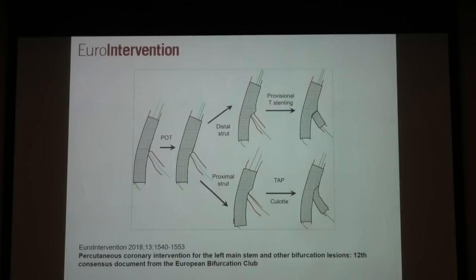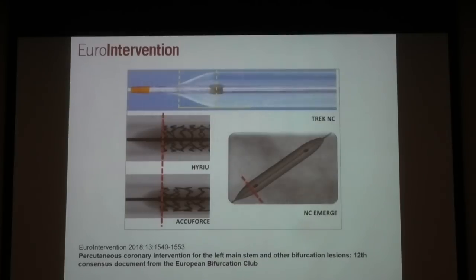And in this case, you wire distal struts of the side branch and you change that single strategy to T stenting. If you want a different technique, TAP or Culotte, you rewire into the proximal struts of the side branch because that has a clinical significance about coverage of the ostium of the side branch. هلا معرفة البالون تبعك والإدجز تبعته والوينجز تبعته بتساعدنا كتير where to position your balloon, particularly if you want to cover the very proximal part of the stent.